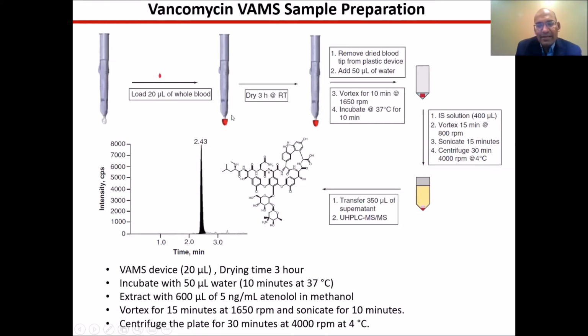In the context of clinical setting, we have established that vancomycin is stable at least for a week at room temperature. So there is some level of flexibility for the clinical team to collect multiple samples and bring them to the laboratory within the next couple of days.